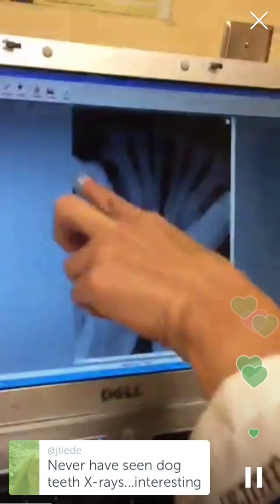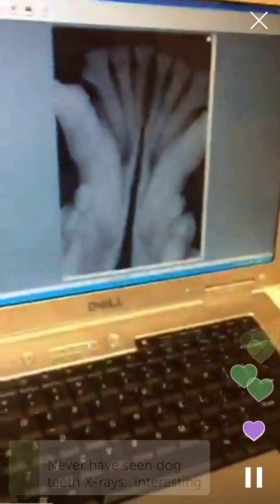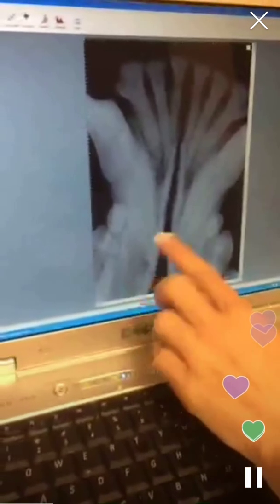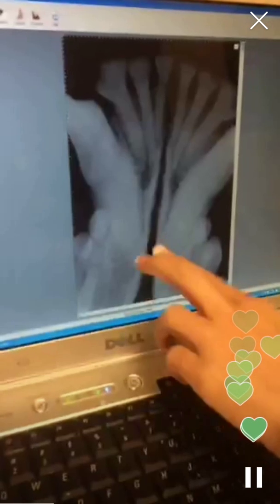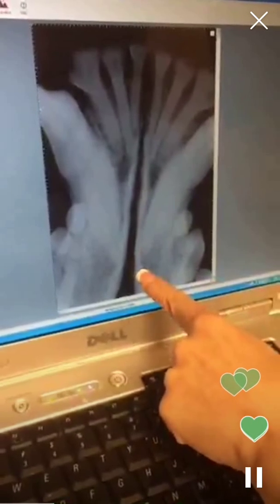And she's not into the pulp cavity. This little line here is the pulp cavity. When they wear away the enamel all the way into the pulp, they can get an abscess. And this is not a tooth we want to abscess, because you can see it goes all the way down to where the symphysis is. There's very little supporting bone here.